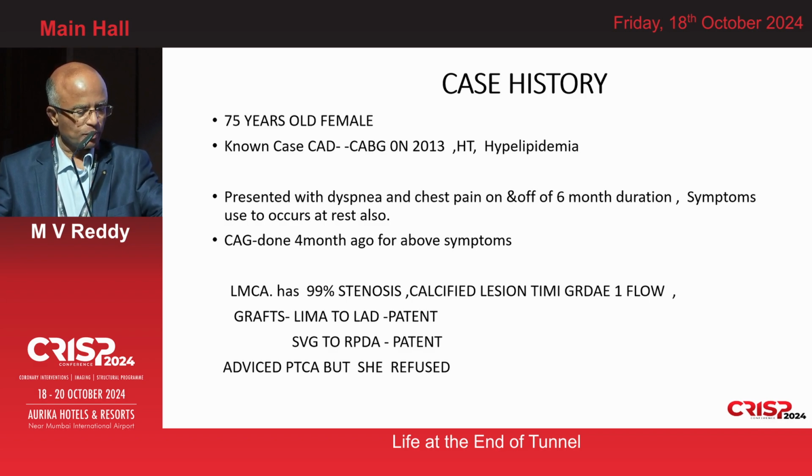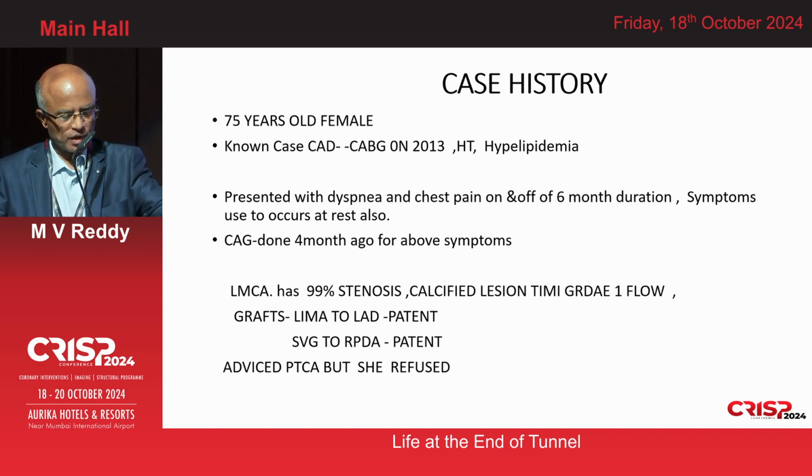Angiography showed the left main coronary artery has a 99% calcified lesion with TIMI grade 1 flow. The graft from LIMA to LAD was patent, and the SVG graft to the right PDA was patent. She was advised PTCA, but she refused at the time.